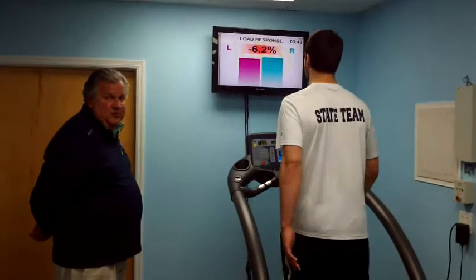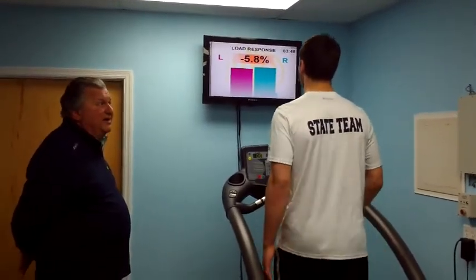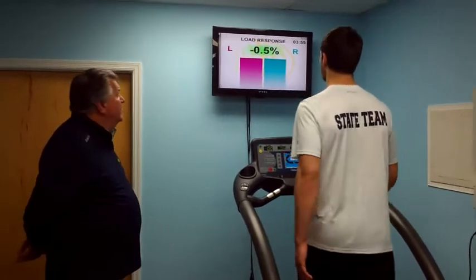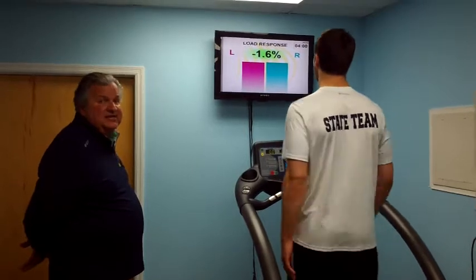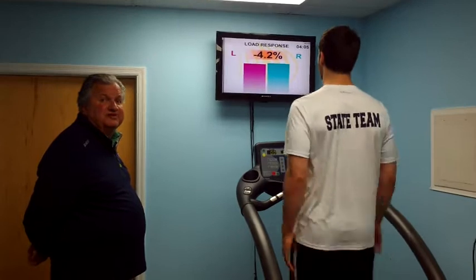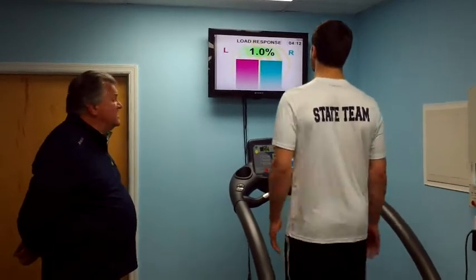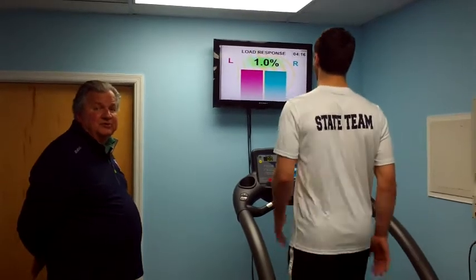So it's very important to recognize that in the gait cycle, we have temporal and rotational components. So when we're rehabilitating somebody, we have to make sure that we look at the temporal components, step, stance, swing, and we look at the rotational components, load response and pre-swing. We do not want to have a situation where we correct the temporal components, correct the step length, the stance, and the swing, and we actually make the other components a little bit worse.